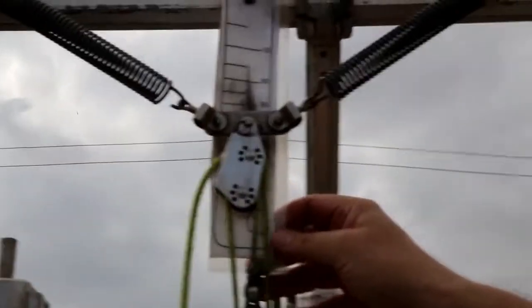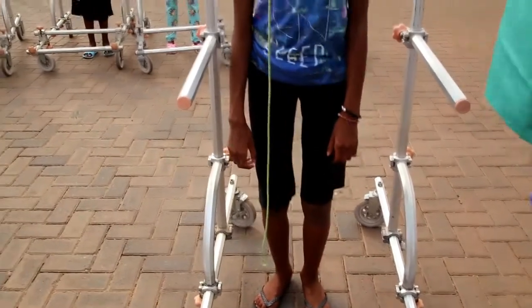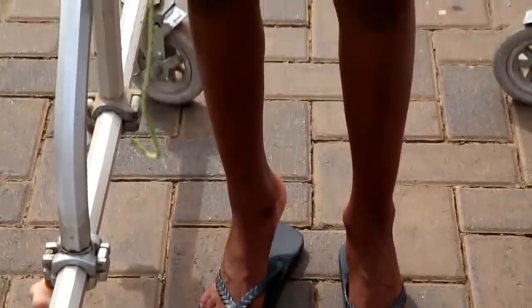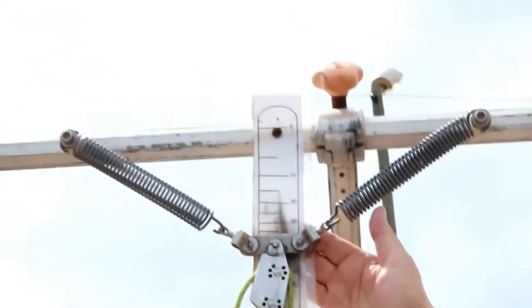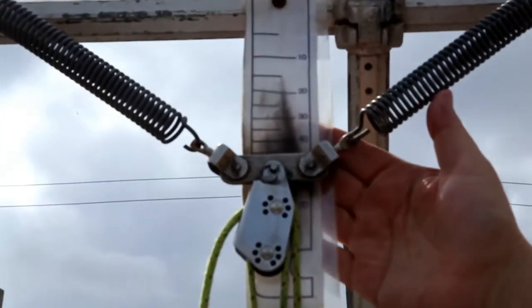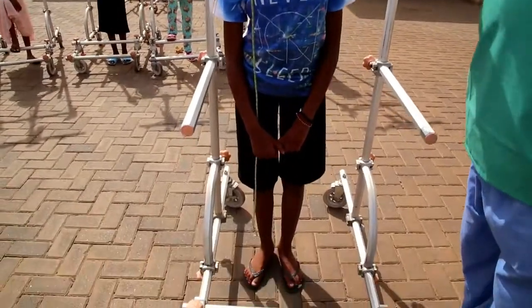An interesting thing happens at 40 pounds: as the patient bends her knees, the load increases — going to 45 pounds when knees are bent. If she goes up on her tiptoes, the load decreases to around 30 pounds. When standing flat-footed, she is just under 40 pounds. We normally set the weight when the patient is standing upright with straight knees — that's when we set the desired load. As patients go up and down while walking, the load will naturally vary on the unit.